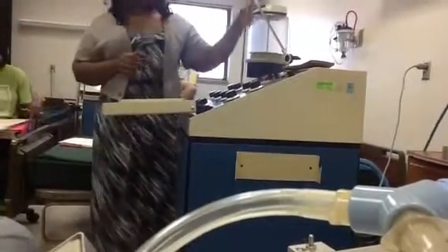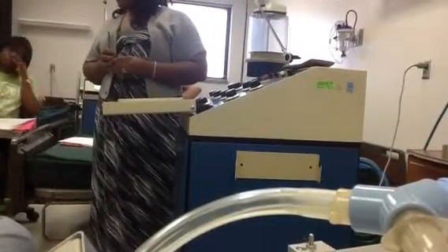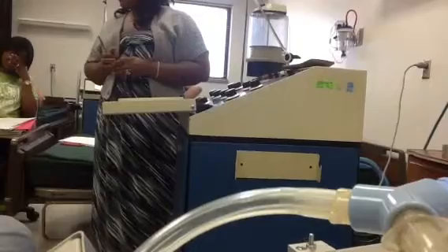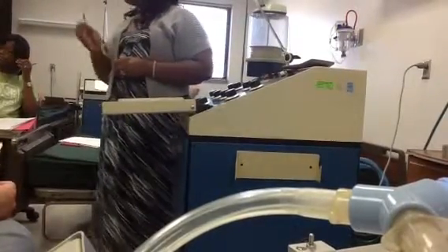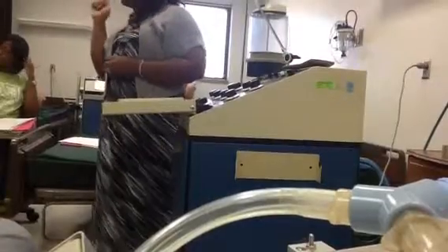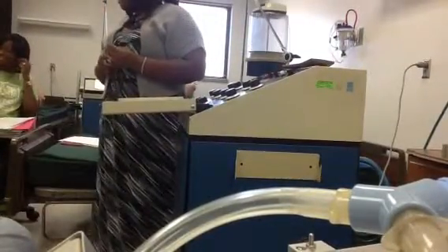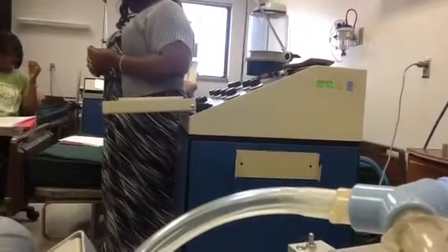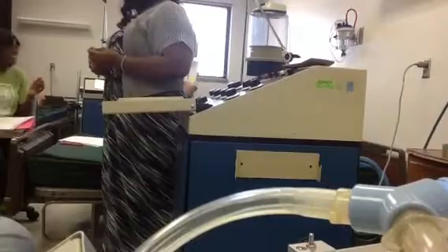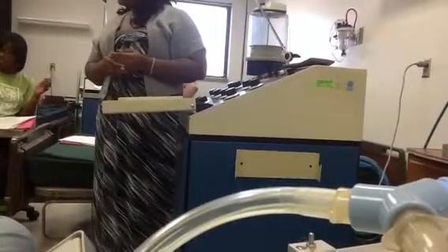The delivered is the same as corrected on the sheet. 0.28 divided by 15 minus 7. And that's the same on most of these. You still have time before you get it done. Hey, we're still getting .047 for static.